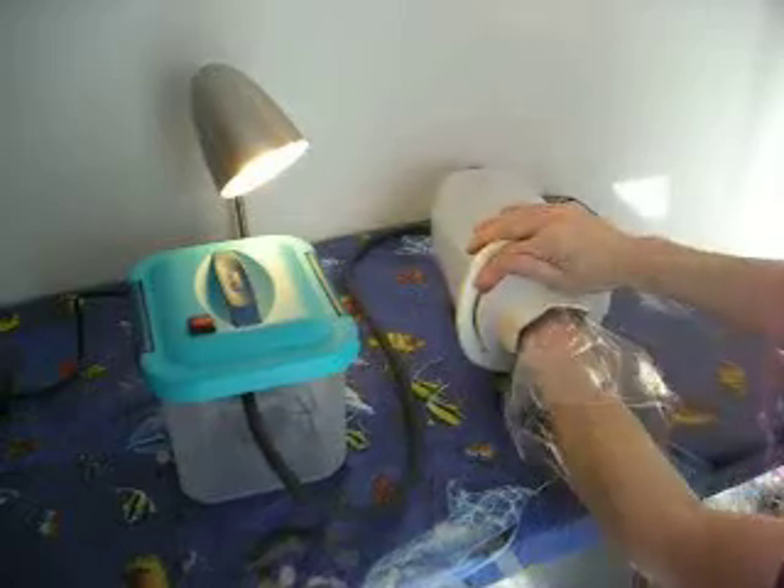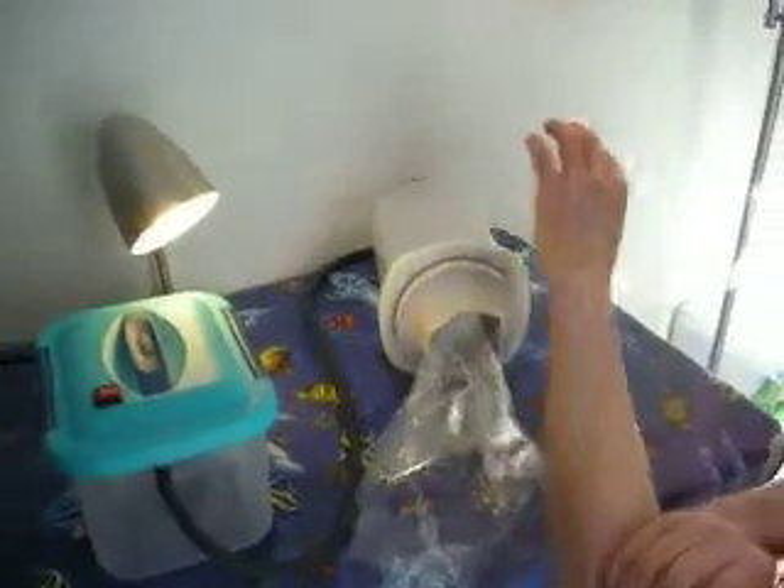Remove the hand, remove the bag, and as you can see the level of vasoprominence. A tourniquet is placed during that time period, simulated by my hand, to maintain the vasodilation that has been achieved by pulling a vacuum on the hand. Notice this vasodilation.